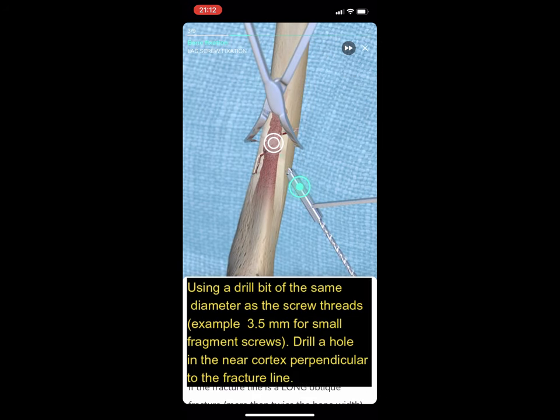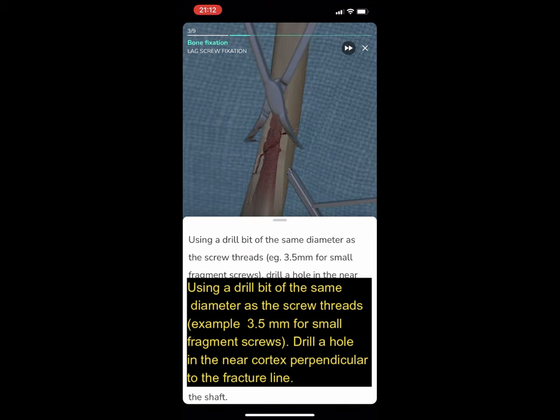Using a drill bit of the same diameter as the screw threads — for example, 3.5 mm for small fragment screws — drill a hole in the near cortex perpendicular to the fracture line.